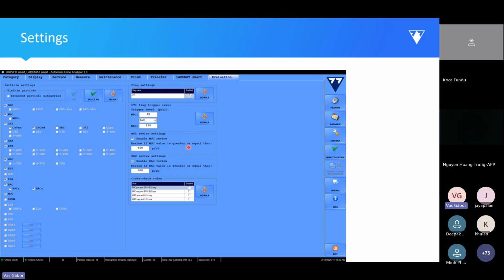The other two flags are also customizable. So that is the mucus flag, which means that you will have a little red empty circle, saying that there is a lot of mucus in the sample, which means that some images or some particles might be defocused, as mucus is not going to sediment to the bottom of the cuvette, whatever you do.